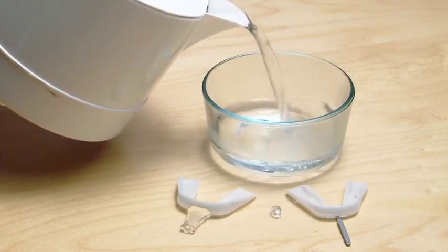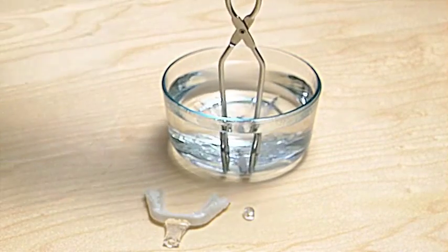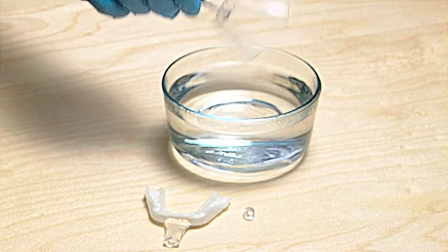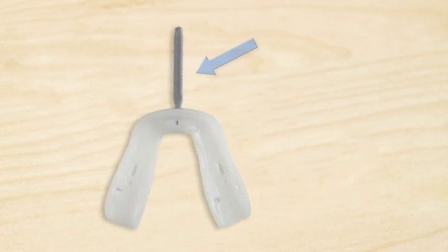Pour boiling water into a bowl. Submerge the lower tray in the water for 1 minute. Remove the tray with a pair of tongs. Shake off the excess water and wait for 20 seconds, allowing the tray to cool slightly. Don't shake too hard because it could cause the hardware to dislodge.